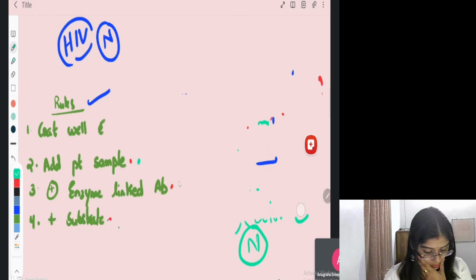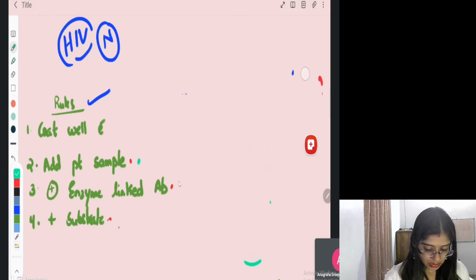Fine. Let's do the second kind of ELISA. What is it? Second ELISA is what, guys? You tell me. Very good. Indirect ELISA.